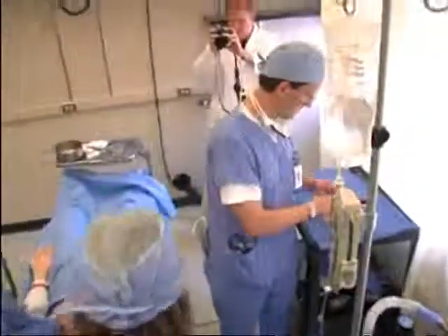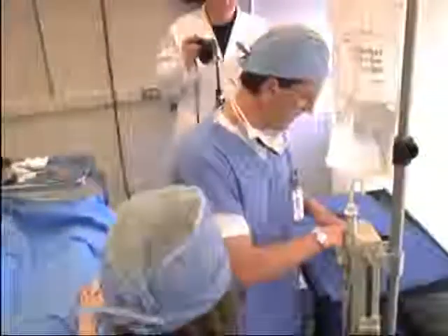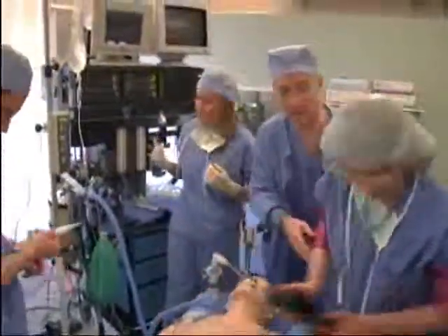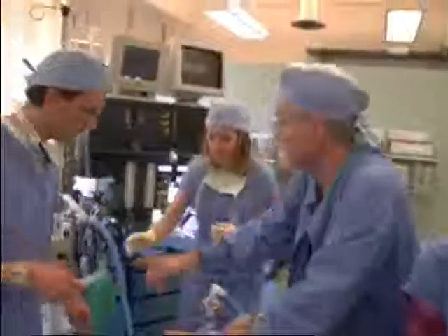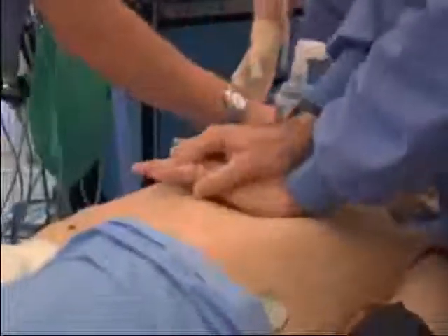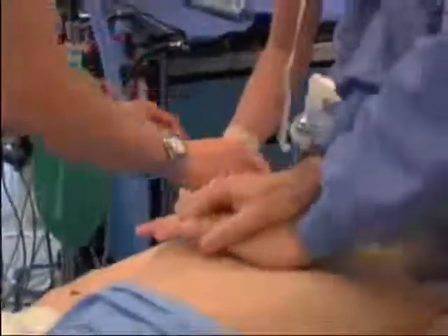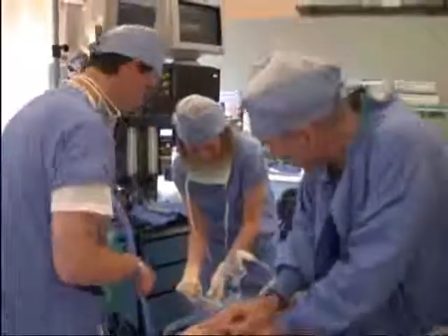I want you to help him get that epinephrine ready. We're ready for the IV. Just going to go into the defibrillator. Go ahead and shock. Nothing. Paddles back. Okay. Start CPR. Can you give us some adrenaline? Where does this epinephrine go? A milligram of epinephrine. Okay, have it set at 360 still. Okay. Bang that in.